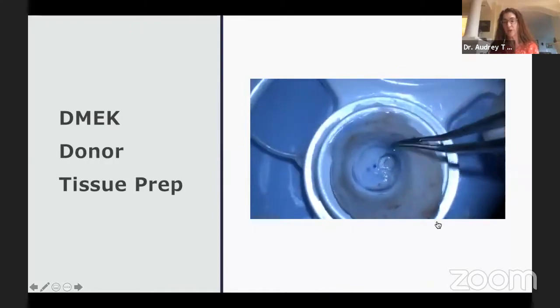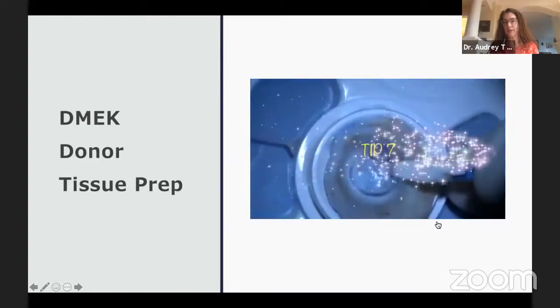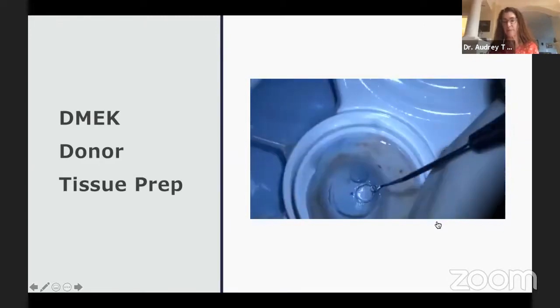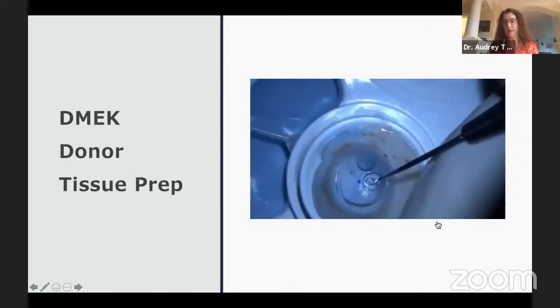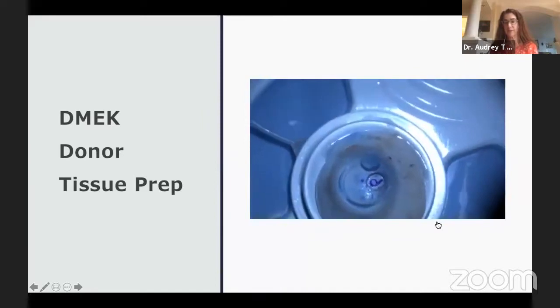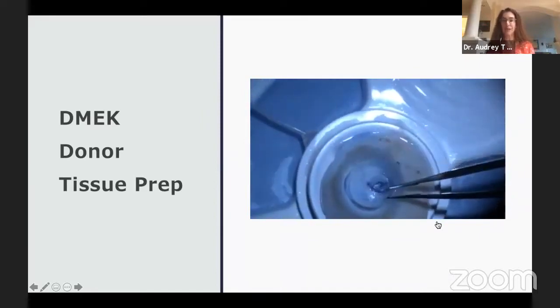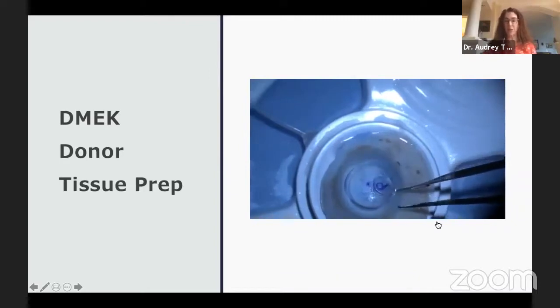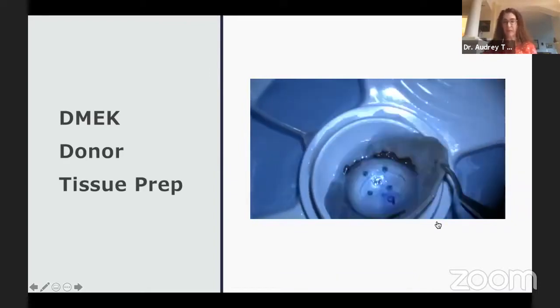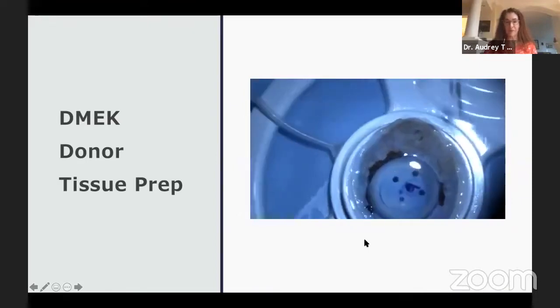You want to be sure it's dried underneath, because if it's not dried, then you will have a problem maintaining the mark. And Dr. Praveen likes to use a P, which is a good orientation mark. Again, whatever letter is your favorite letter to use that has some sort of orientation is a good one to choose. And then there you have it, you've got your graft.